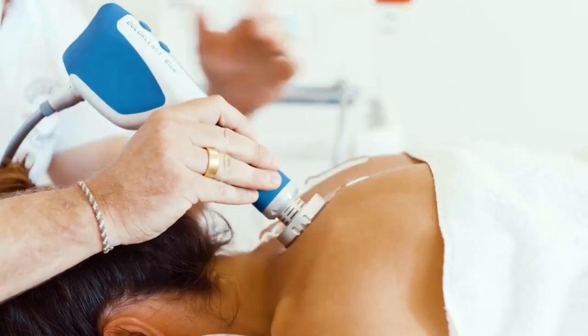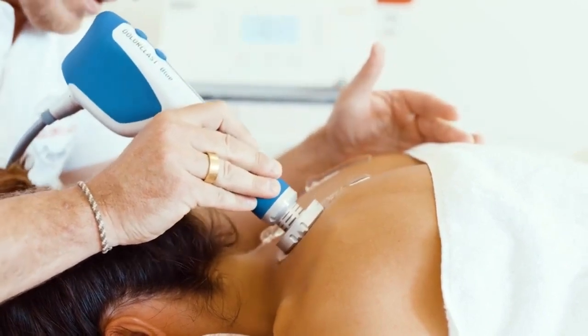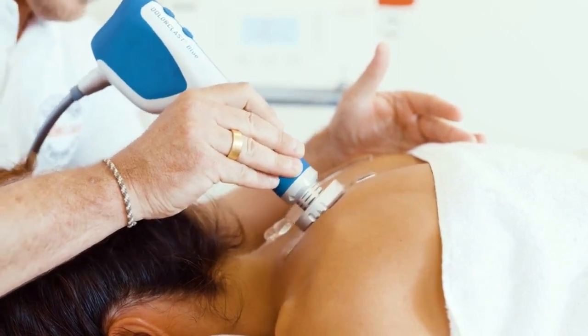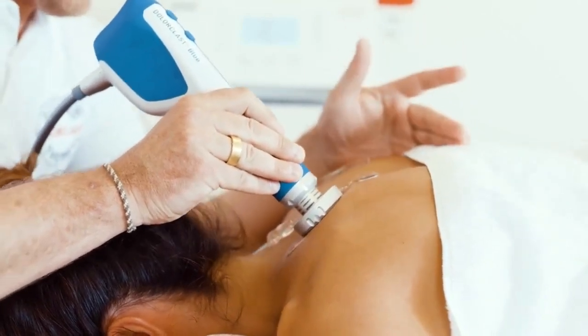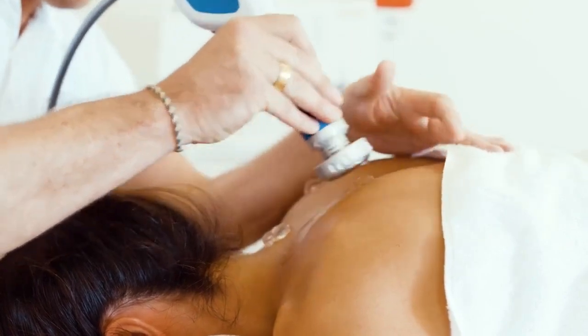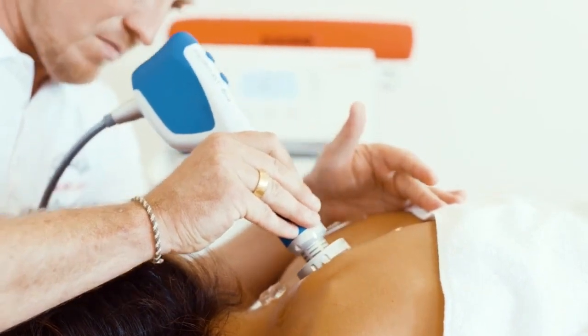When treating the cervical region, it is crucial to consider the air-filled tissue underlying the lung. The pressure waves, at 2 to 4 centimeters maximum penetration, should remain outside of the lung. The application may generally cover the region or a specific anatomical structure, like shown previously with the lumbar application.